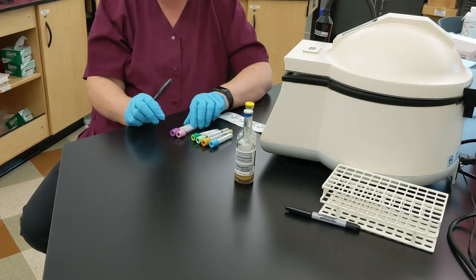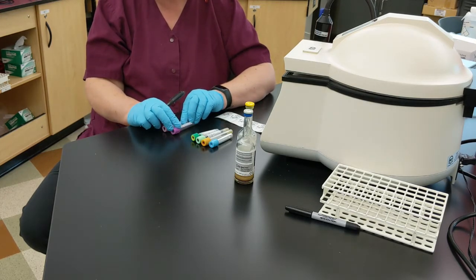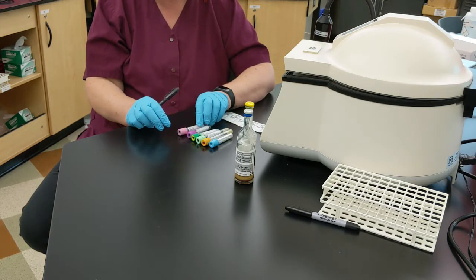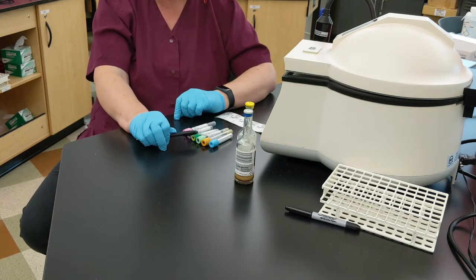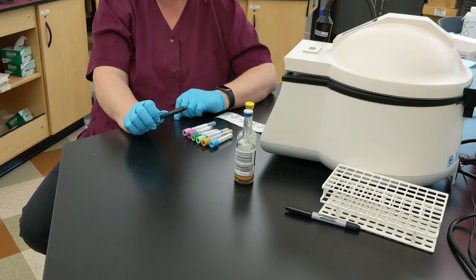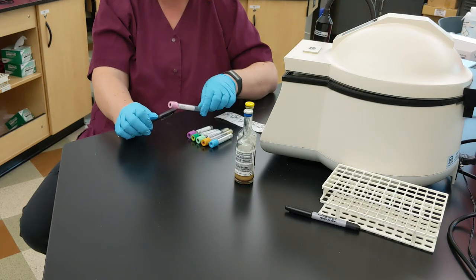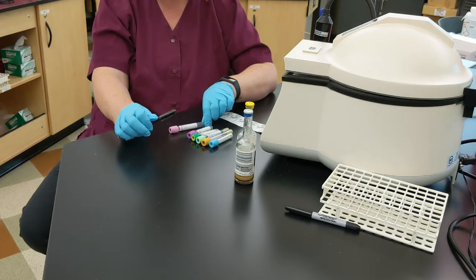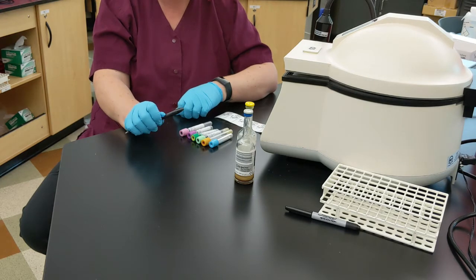Then you have your purple top, and that is K2 EDTA — the K number is potassium. We want to have that last because we don't want to accidentally contaminate our chemistry. Potassium is one of those electrolytes, and we don't want to inadvertently have the anticoagulant from the tube misleading what's happening in the patient.